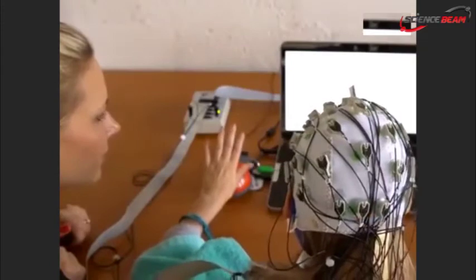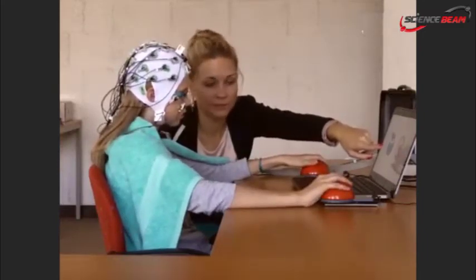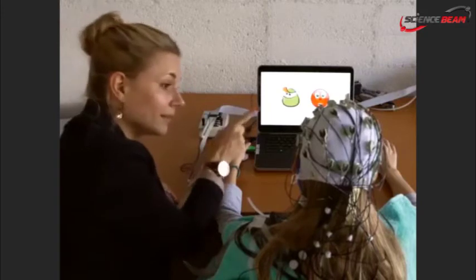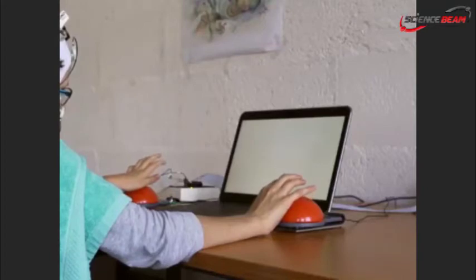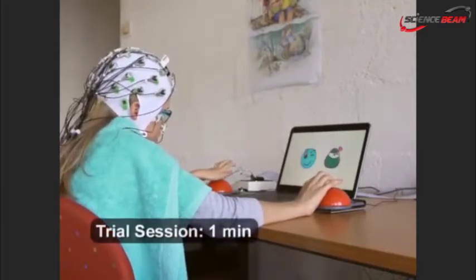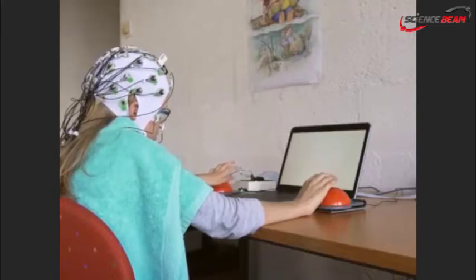Finally, when a stimulus is presented on the computer screen, use a stimulus delivery and experimental control program that is time accurate to send time-locked markers to the data acquisition protocol. Instruct the subject to respond as quickly as possible to the target stimuli. Before starting the experiment, conduct a short trial session lasting no longer than a minute. This method can help us answer key questions related to underlying cognitive factors that might contribute to different disorders.